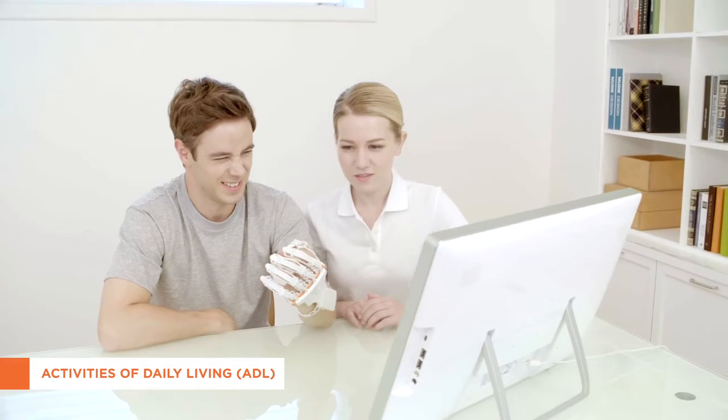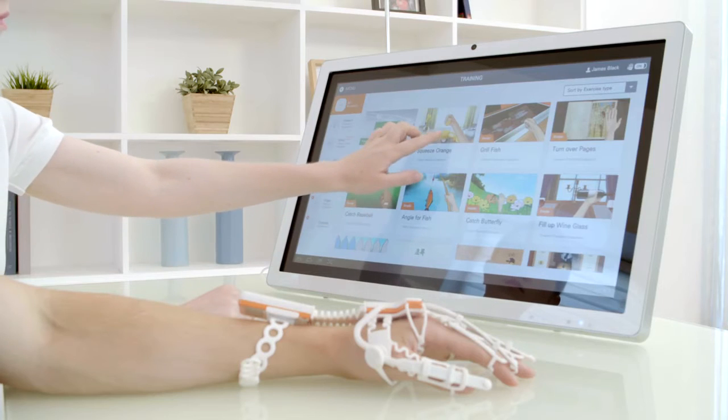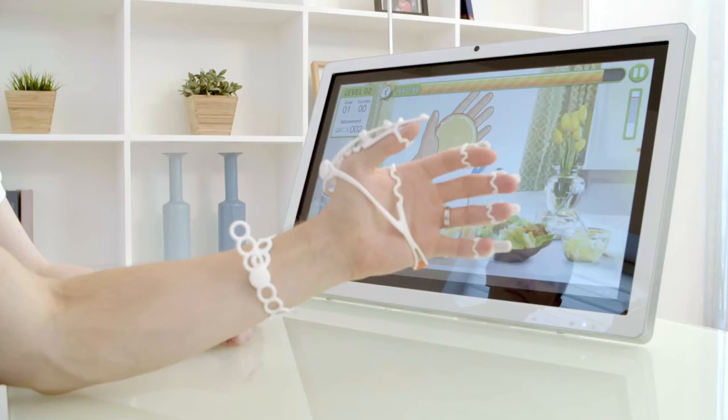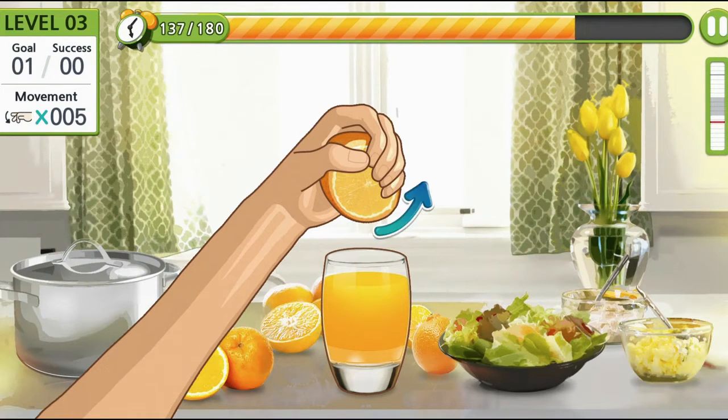The ultimate goal of rehabilitation is to return to family, job and community. To make a patient comfortable when he returns to ordinary life, the patient repeats hand and arm movement suitable for his condition and rehabilitation goal, thus preparing them for a successful return.